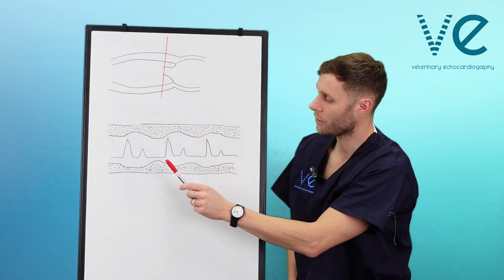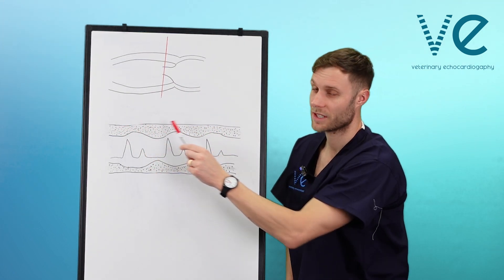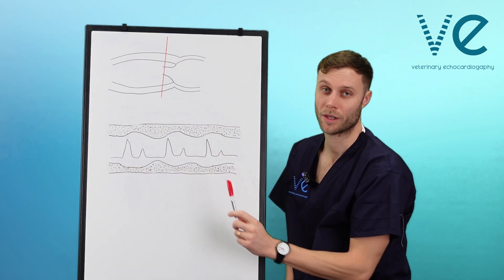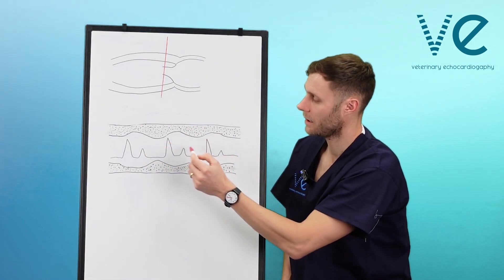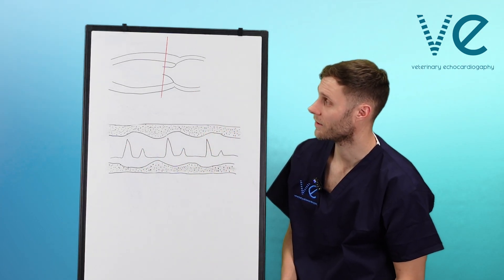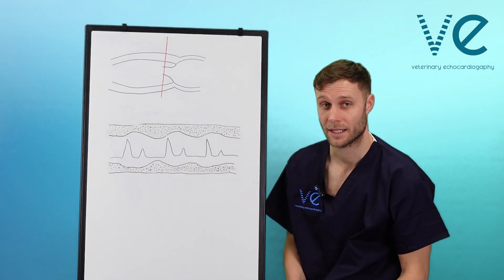When we put the M-mode through and bring up the trace, you should be able to see a clear delineation of the septal wall, and also a clear delineation of the free wall at the bottom — both echogenic because of the muscle. In between this, you will get the left ventricular cavity, and as long as your M-mode is through the tips of the mitral valve, you will get the mitral valve movement through systole and diastole.